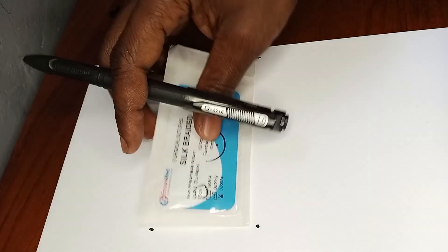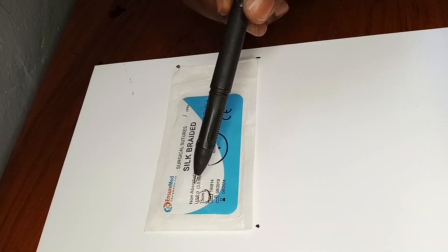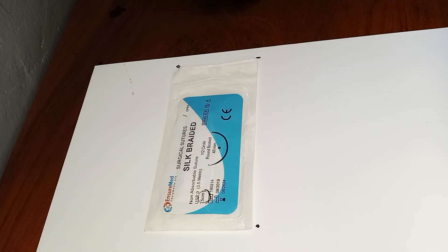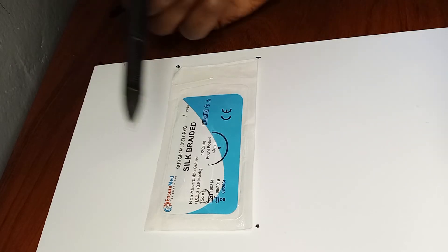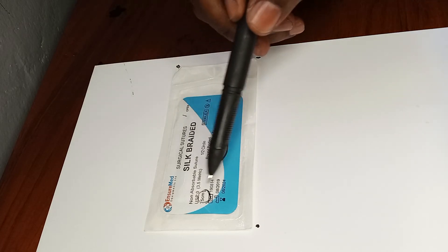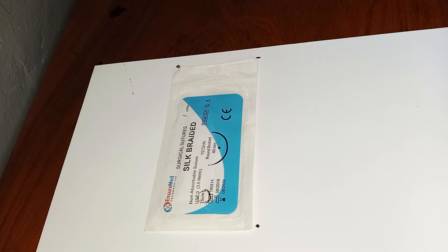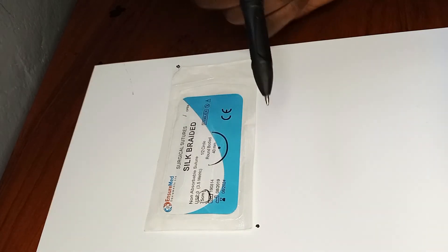The next suture is silk. Unlike what we've looked at, silk is non-absorbable — wherever you put it, it's not going anywhere. The body cannot hydrolyze or absorb it. This particular silk suture is size zero, so the thread thickness is smaller than the Vicryl, which was a size two. The length of the thread is 75 centimeters, the same as the Vicryl.